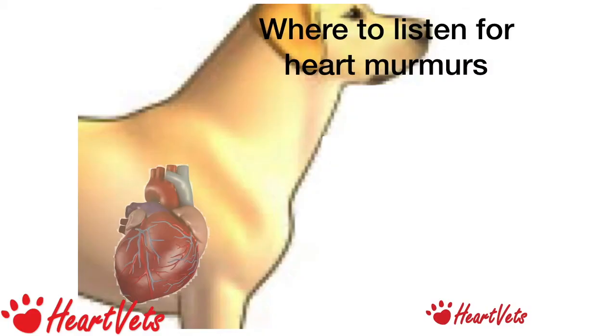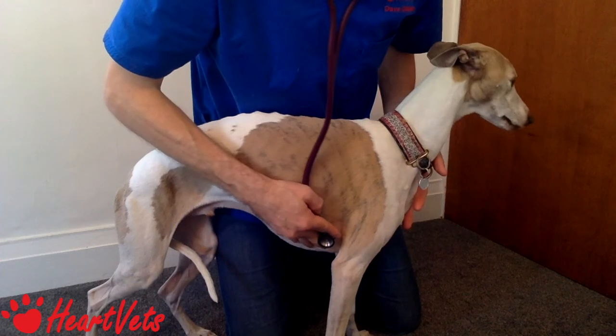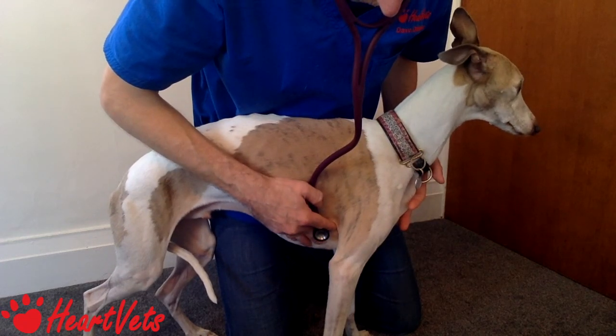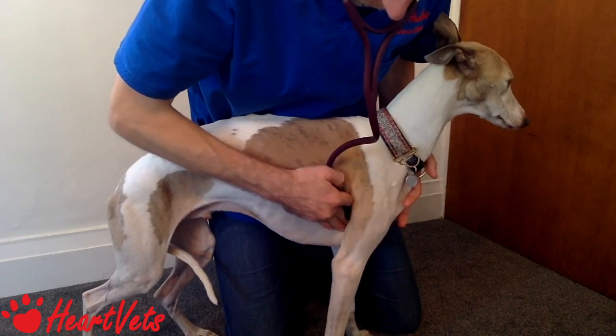On the right-hand side we've got three regions. A is for Apex — listen where you feel the apex beat most strongly, and there you'll hear sounds across the tricuspid valve. B is for Base — move the stethoscope dorsally and cranially slightly, and you're listening again over the aortic valve. C is for Cranial — push your stethoscope a little bit further forward; this is where most VSDs will be loudest. So that's Apex for the tricuspid valve, Base for the aortic valve, and Cranial for a VSD.